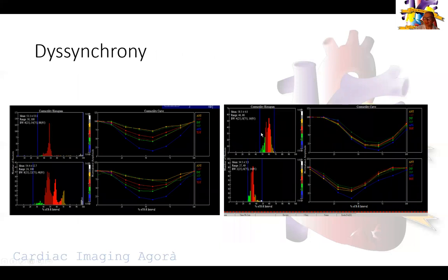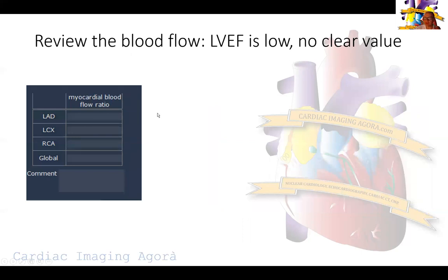Next we look at synchrony. On the right hand side I always put an example of a normal synchronous ventricle from a different patient. On the left you can see how dyssynchronous this ventricle is at both rest and stress — the segments are not contracting in harmony and not reaching peak contractility at the same time or to the same extent. We define a standard deviation above 8 as indicating dyssynchrony. This patient shows a standard deviation of 12 and 13 post-stress. We do not calculate blood flow in patients with low ejection fraction as the specificity is unclear.